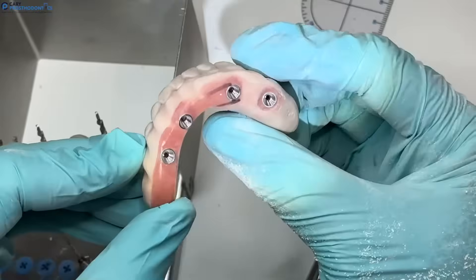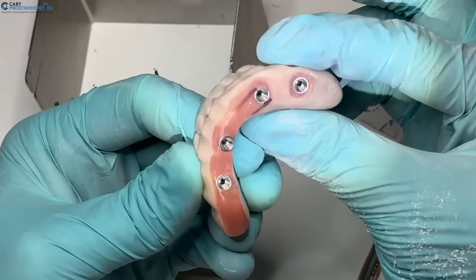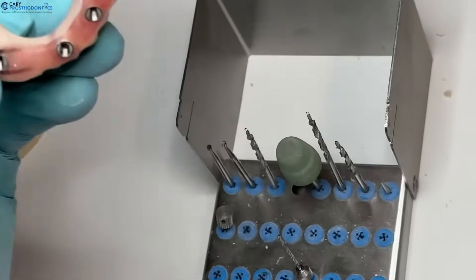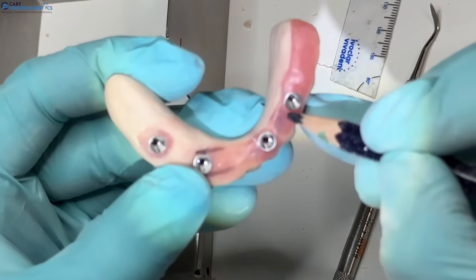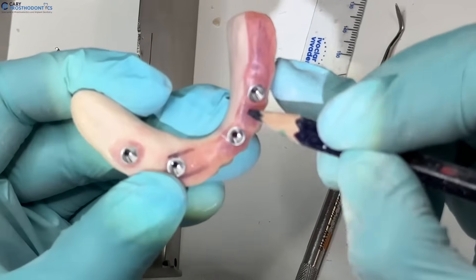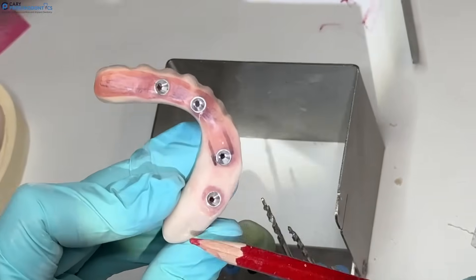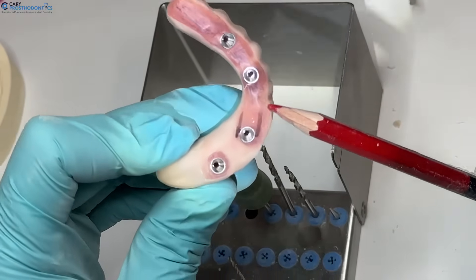Looking at the pre-picked-up portion on the right side, you can see how much thicker everything is. The way I've contoured on this side, only the marked area will be touching the tissue. This side might be one way of contouring if you're worried about fracturing, but I like to debulk mine like this, especially when using a monolithic denture.